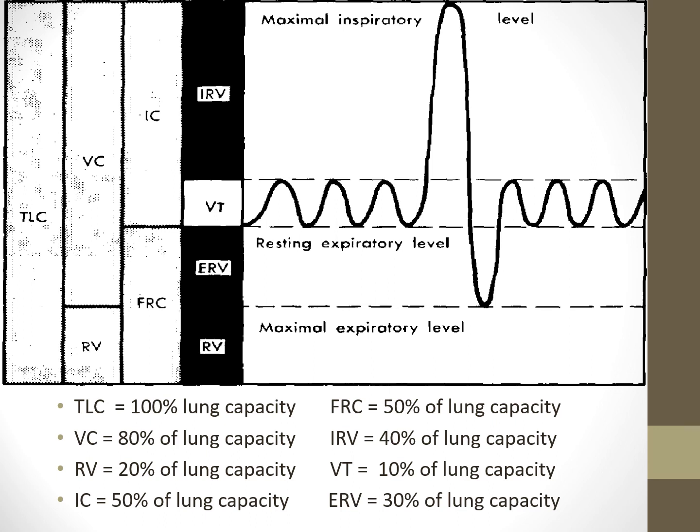This is hopefully something you remember from the last class, and this is just where we're adding percents to this whole thing. When we're having a patient breathe for a pulmonary function test, this is what we're looking at here, and I'll use red here. So we're going to have the patient breathe tidal volume, which is just quiet breathing in and out. Then we're going to say take a deep breath in, as deep as you can to the maximal level, and then force that breath all the way out till they can't exhale anymore, so they hit down to the residual volume. And then once they're all the way out, go back to breathing normally again, right? As much as they can.